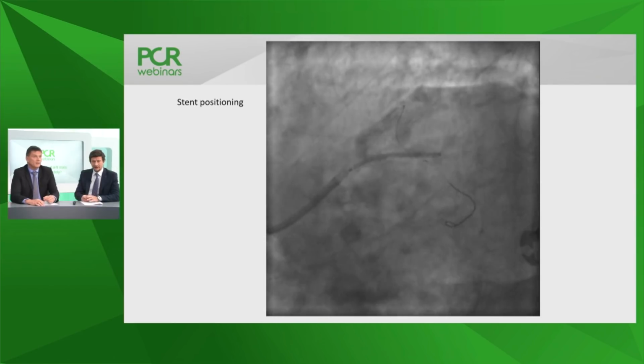That's large. I have a question now regarding the stent size. That, by the way, was also one of the points made by the colleagues. And when addressing this question, please tell me whether IVUS, and this is more to you, Flavio, had any impact on your stent size. Because, of course, you did IVUS, you might have performed your measurement. You went here for a 5 millimeter stent. I'm sure you thought to the proximal landing zone of the stent, to the left main, right? But if I look at this circumflex, at least angiographically, it doesn't seem to be 5. So can you share what was the decision strategy there?